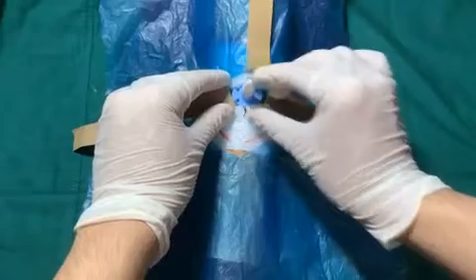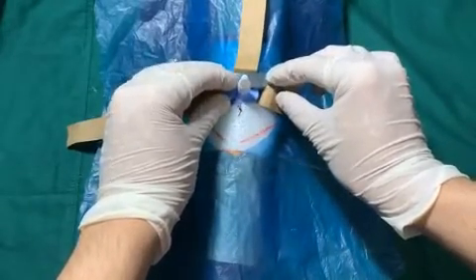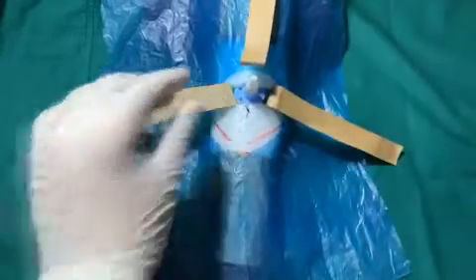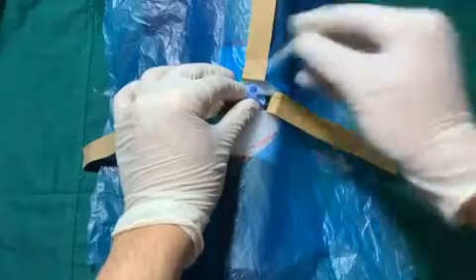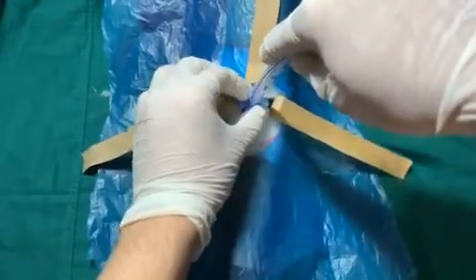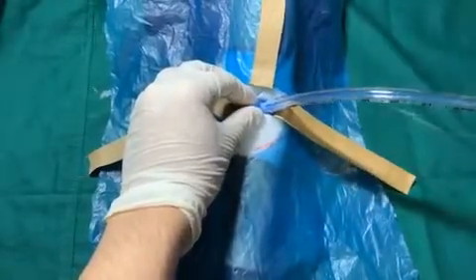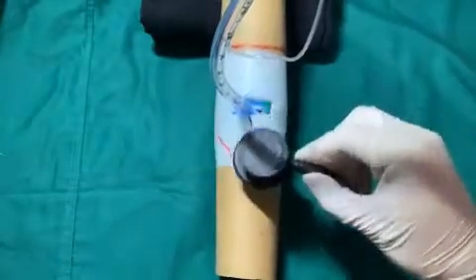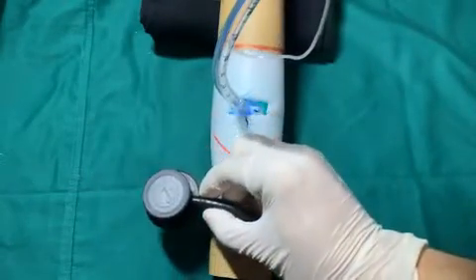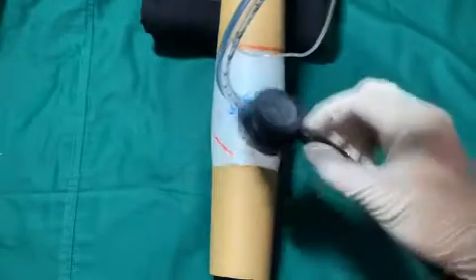Ensure that the tube has been inserted into the tracheal lumen and not in the false passage in the paratracheal soft tissues. Remove the obturator and insert the inner cannula. Ventilate while confirming for the correct placement of the tube within the trachea by checking the expired PCO2, chest movement, and listening to the breath sounds.